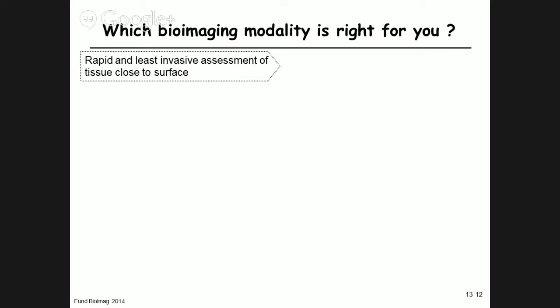Rapid, least invasive. Well, we can think pregnancy. What technique do we use there? That would be ultrasound. It is rapid, it's immediately reconstructed, it's not very invasive, it's bedside. You just need some gel, the transducer, and you do the image.